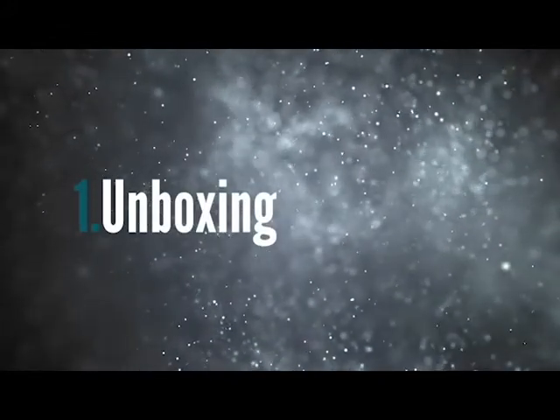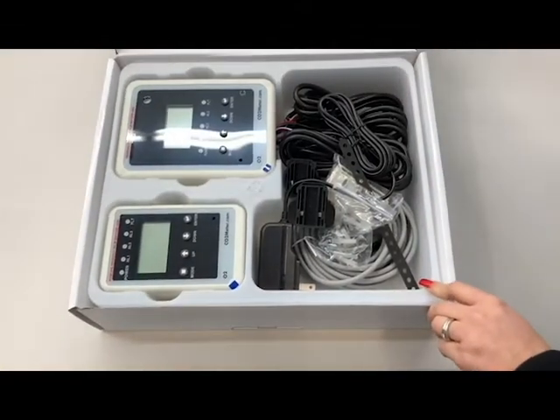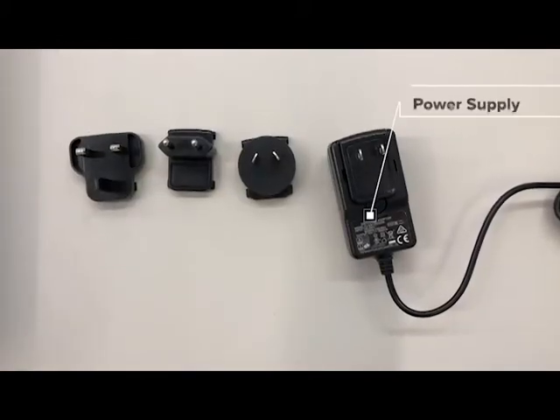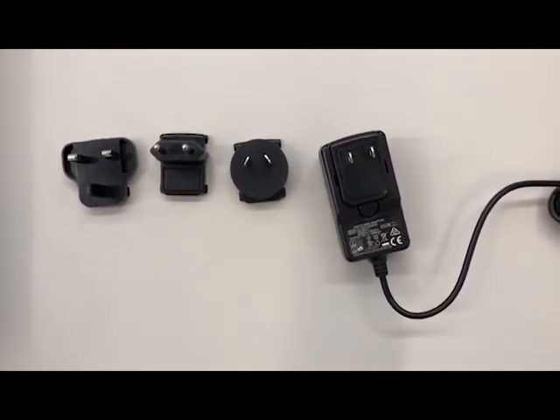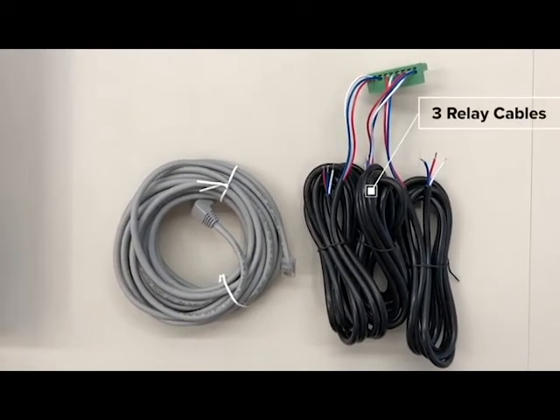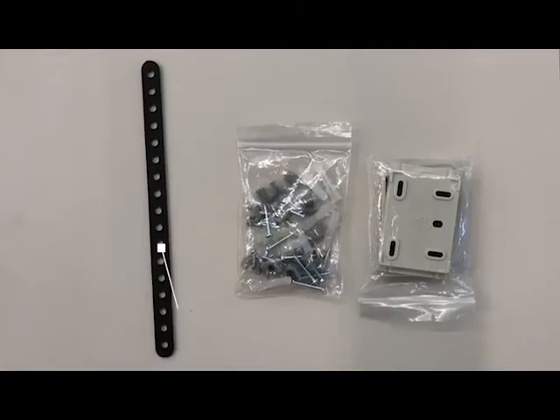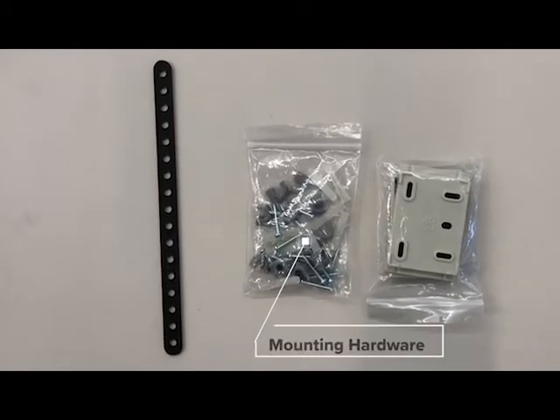Before we begin, let's take a look at what comes with your remote oxygen depletion safety alarm. Within the box you should find one remote display unit, one main sensor unit, one pre-wired power supply, three different international power adapters, one 25-foot CAT5 cable, three relay cables — these come connected to the device but can be easily removed if you are not connecting the RAD0002 to external devices — one wall plug safety strap, two mounting brackets, and one bag of mounting hardware.